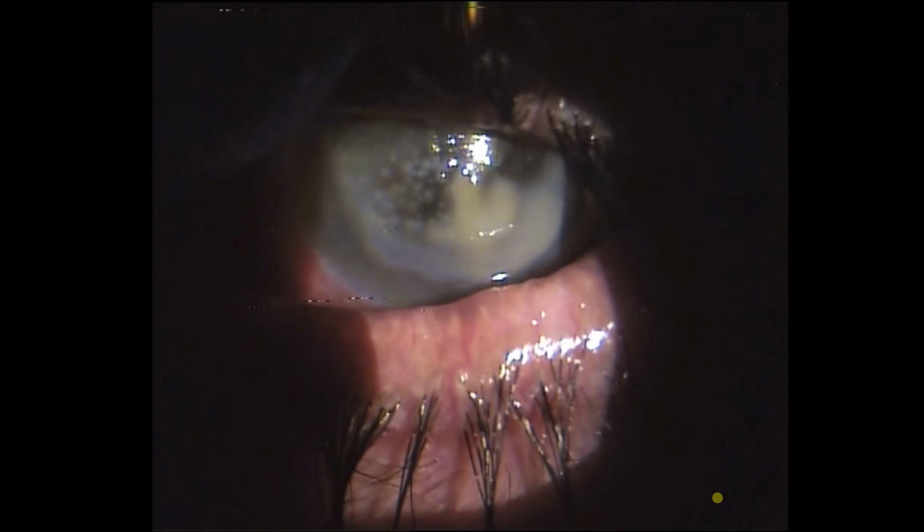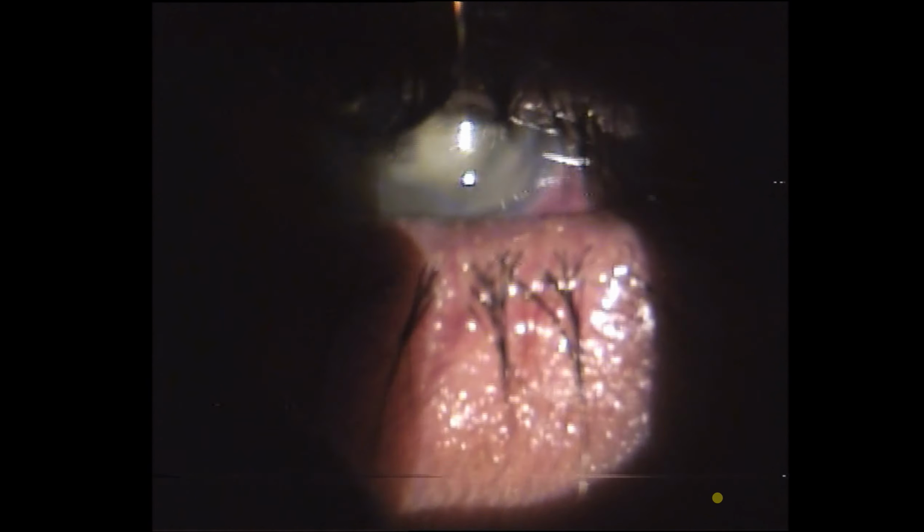So what you need to do is a diffuse illumination, reduce the intensity of light just to have a look, and then do an advanced slit lamp examination. You can see his lid margins look a bit irregular, signs of chronic blepharitis, and you have to be careful opening the eyelids in these patients because they are really tender. Whenever you want to look at the cornea, you need to have your slit beam at a higher magnification to increase the illumination according to the photophobia of the patient.